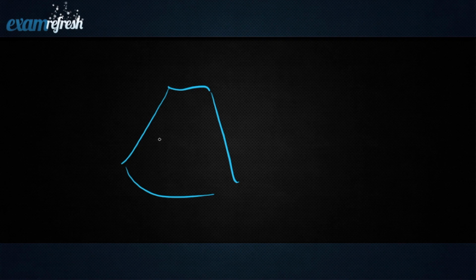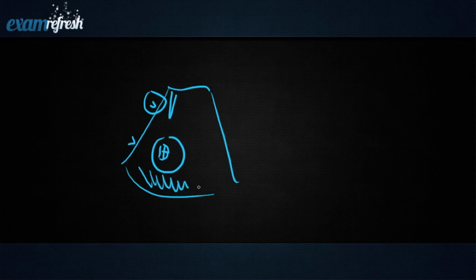So let's say you have a fetus in here and you're trying to image this little heart that's sitting in here, and you have 2 focal zones. This one right here is unnecessary because it's just taking an extra pulse to image up here, in an area that we're not even concerned with. So when trying to image a fast moving structure like that, put in 1 focal zone, decrease your depth, and make sure there's no extraneous information behind, because you're trying to maximize for temporal resolution. So remove focal zones, decrease your depth.